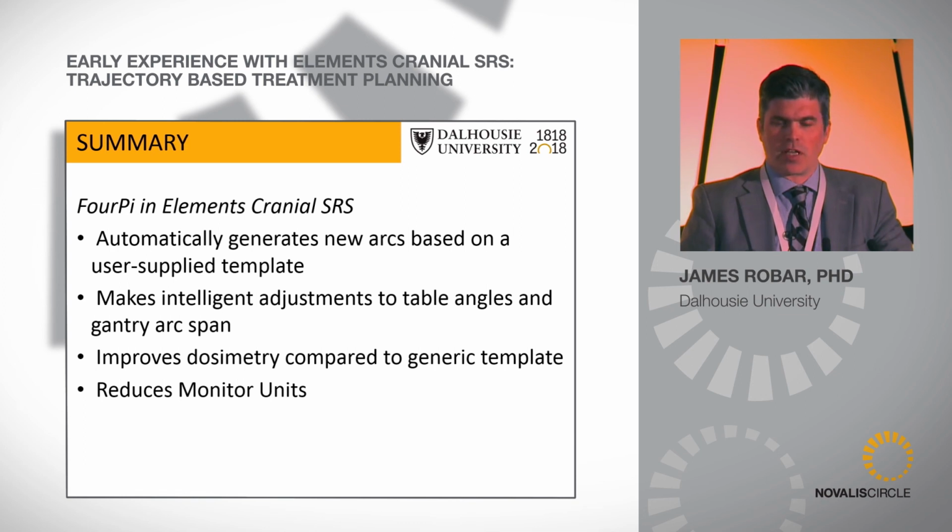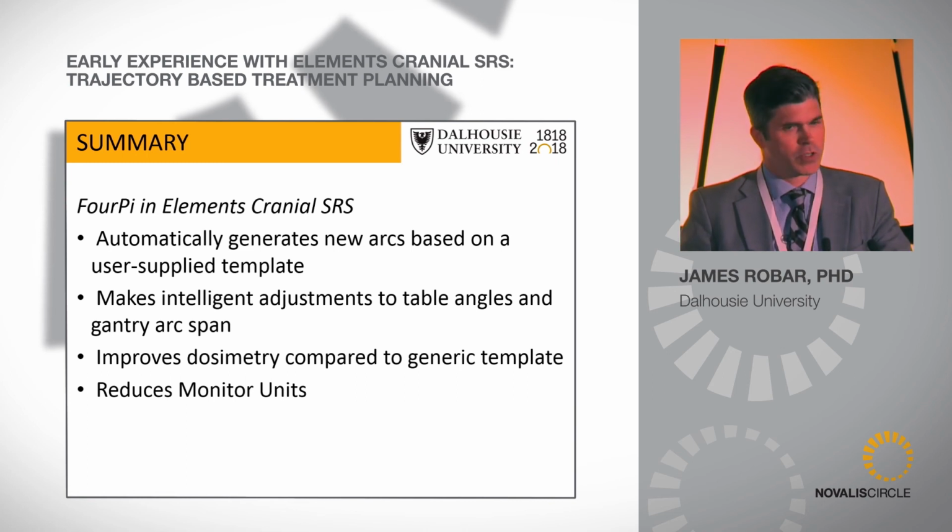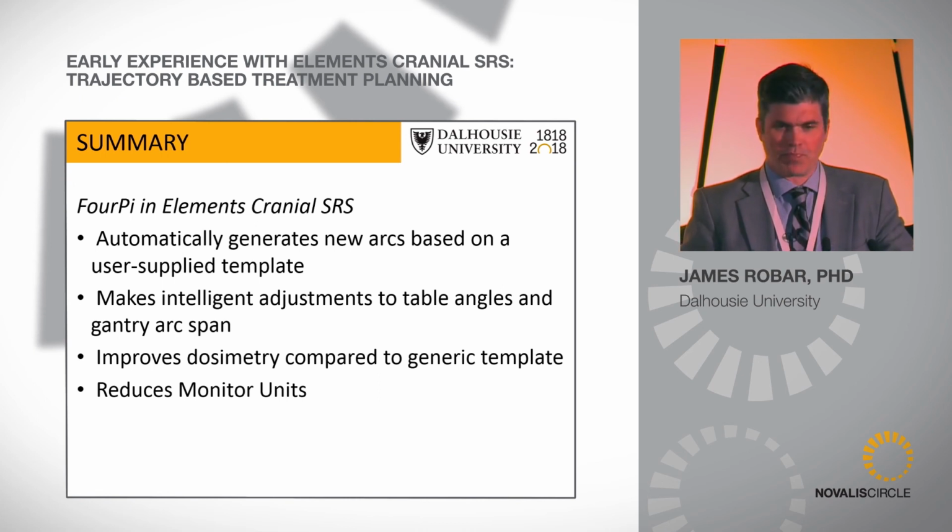New arcs are generated based on a user-supplied template. So that's actually a very pragmatic approach. It starts with something that is comfortable to the treatment planner and modifies it from there. It modifies by optimizing first couch angles and then gantry arc span. And in many of the cases, the dosimetry was improved for brainstem and optic structures. And by simplifying arcs in terms of the intersection with organs at risk, it becomes more efficient.